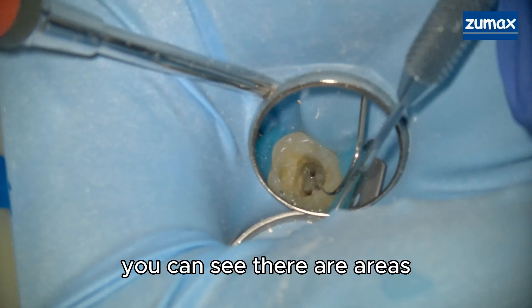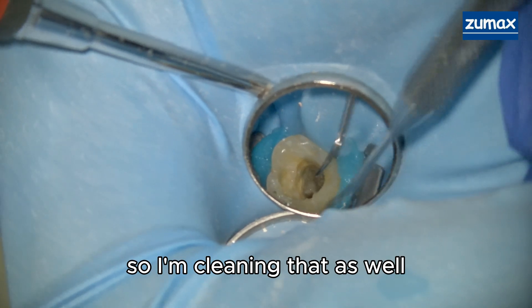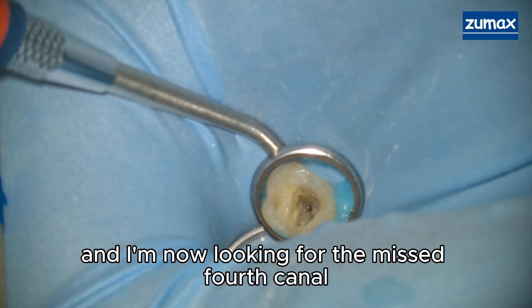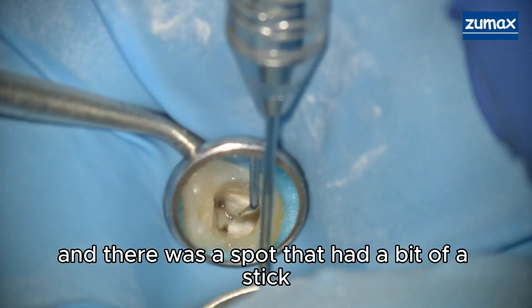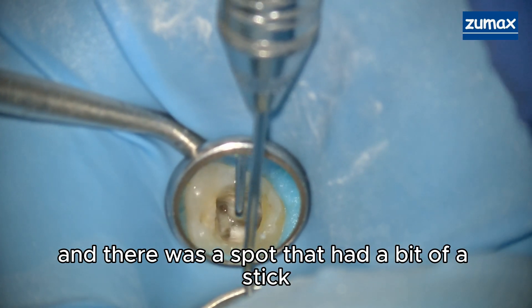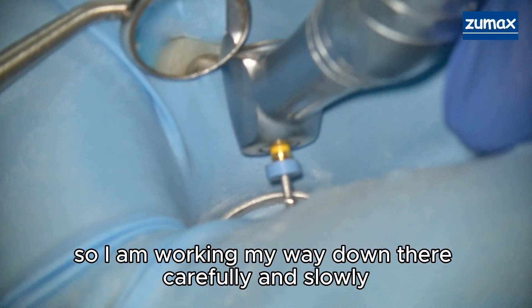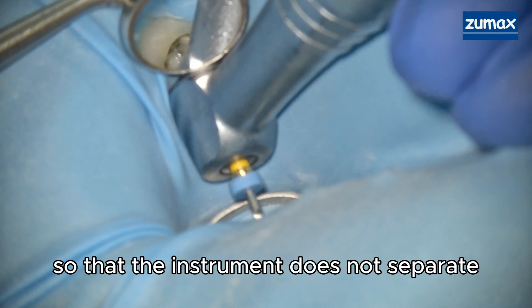You can see there are areas of the tooth that were not properly cleaned out, so I'm cleaning that as well. I'm now looking for the missed fourth canal, and there was a spot that had a bit of a stick, so I am working my way down there carefully and slowly so that the instrument does not separate.